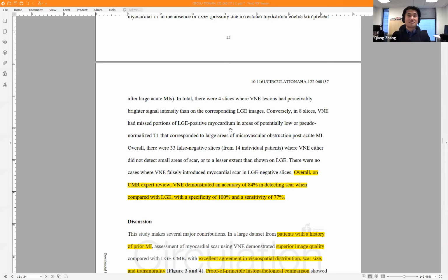So this is a great question, actually. When we train the neural networks, we train those models only on the LGE images with good quality, and then we tested the methods on all the LGE images. That means when the algorithm is learned on the good quality images, it learns to produce a good quality LGE, despite the real LGE images in the test set being inferior in image quality sometimes.